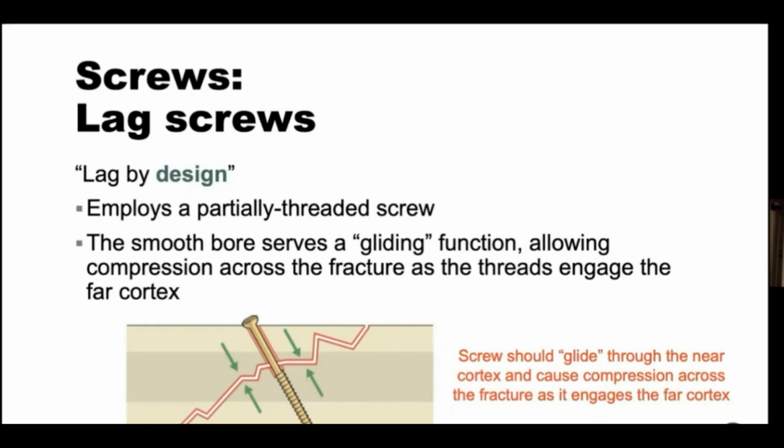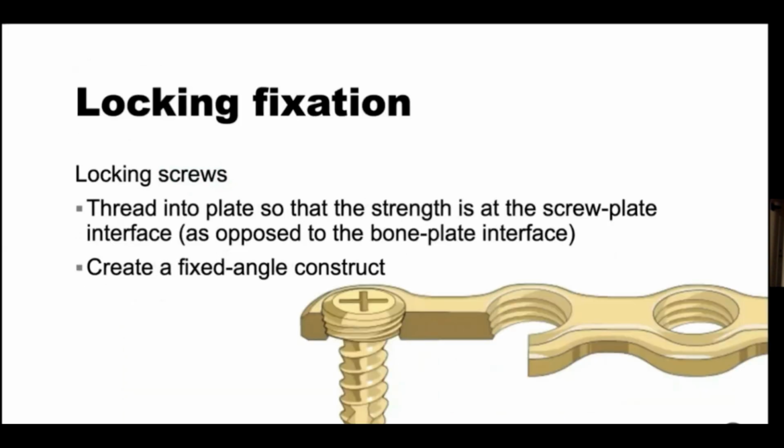And so these, lagging by technique, lagging by design, compression through the plates, these are how you get interfragmentary compression, which gives you absolute stability at the fracture site. And then the last thing I want to mention is locking fixation.